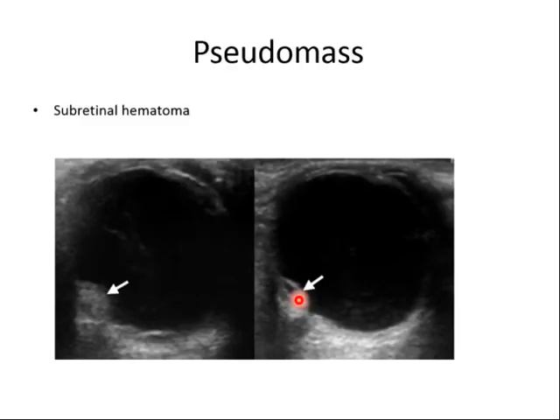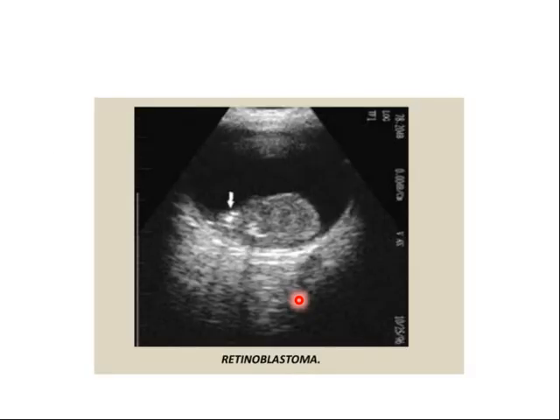But that can also be a melanoma. Here it's hyperechoic with a narrow base. Except for the age, maybe melanoma, but melanoma is a low to medium echogenic tissue with no calcification. But maybe hemangioma. In hemangioma there is calcification and hyperechogenicity, but little vascularity. But here there is vascularity on Doppler. So Doppler is of paramount importance in these cases.